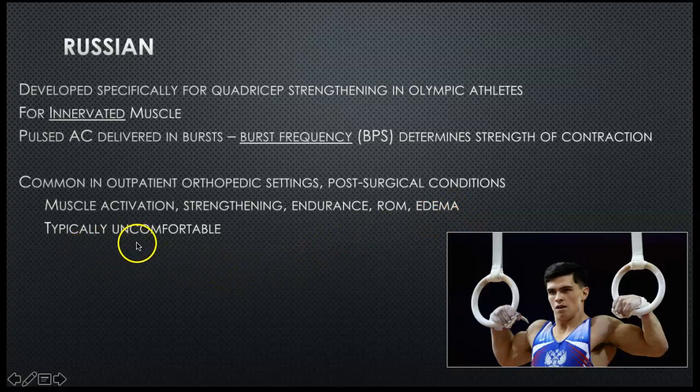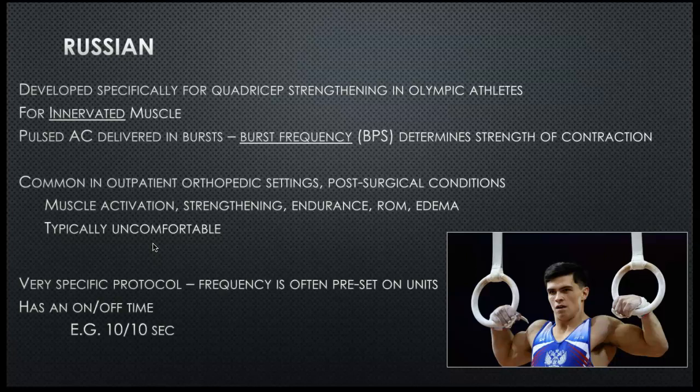It is typically uncomfortable. And you will figure out how to word this to your patient. Like, this isn't going to feel good. If any of you have had it, you know it's very strong. You have to turn it up really. The amplitude has to be pretty high in order to really get a contraction. But it's not damaging anything, even though it feels kind of uncomfortable or very, I don't want to say shocking, surprising to people. But you got to tell them that ahead of time, right? But you're trying to turn it up pretty high so you can get a visible contraction.